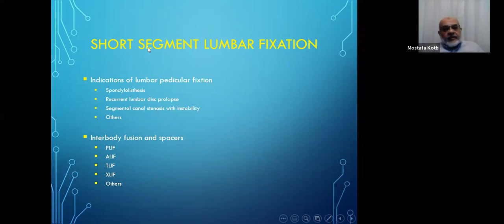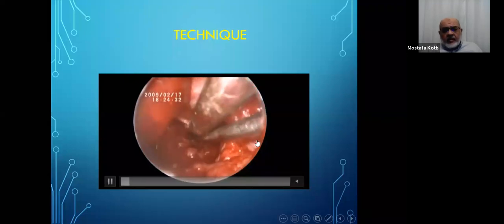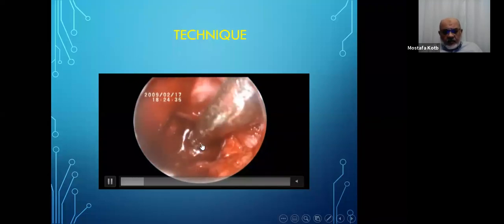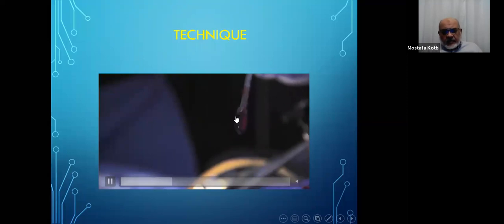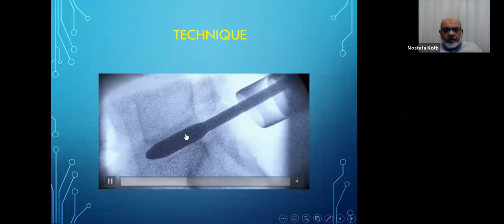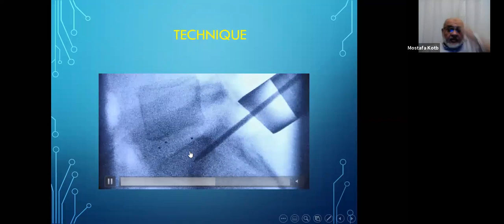In lumbar fixation, you know all the indications for a lumbar pedicular fixation for a short segment, whether you do only pedicular fusion or interbody fusion. In this technique, I'll show you what I do for a single level. I first do the regular discectomy using the endoscope as I showed you before. And at the end of the surgery, when you have a good disc decompression, you just introduce the cage filled with bone into the disc space under fluoroscopy.